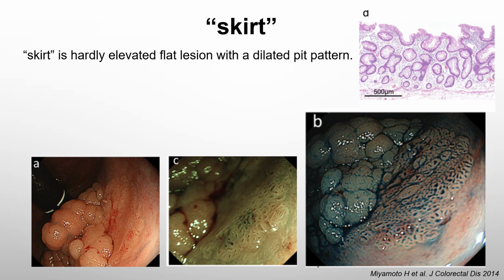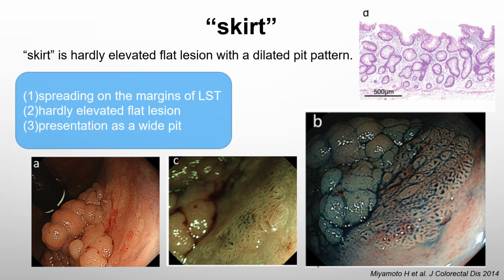The skirt extended along the margin of a LST-GM and is a hardly elevated flat region with a dilated pit pattern. Identification of the skirt in rectal LST-GM. Macroscopically, the region consisted of not only the aggregate small and large nodules that are typically seen in LST-GM, but also hardly elevated flat component.